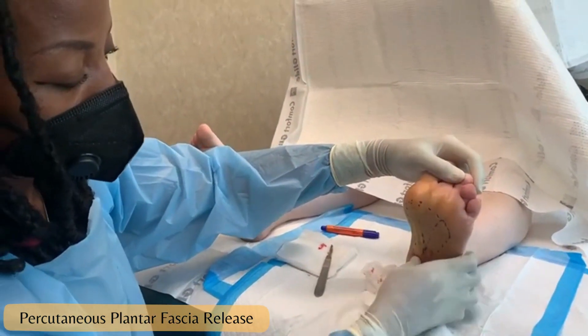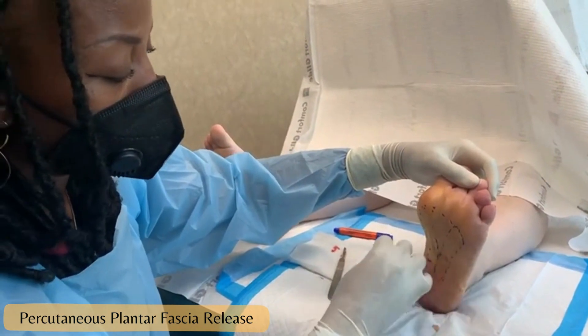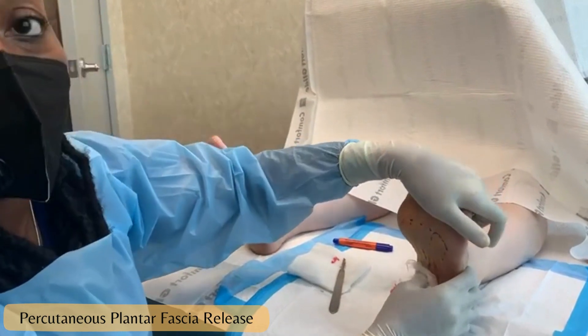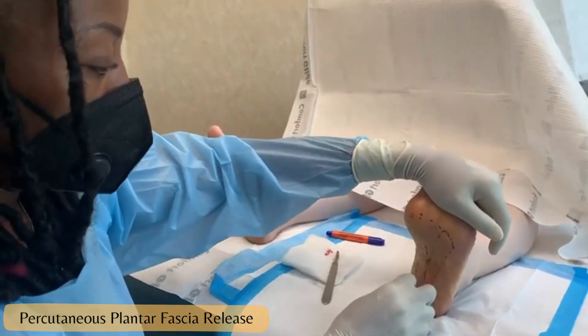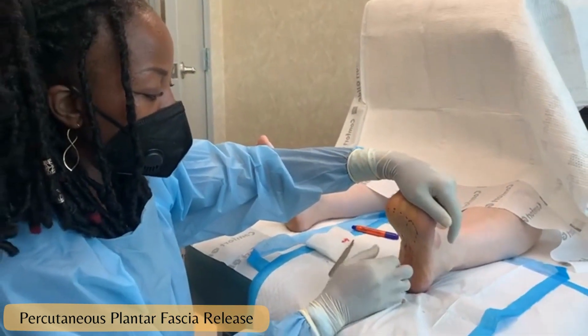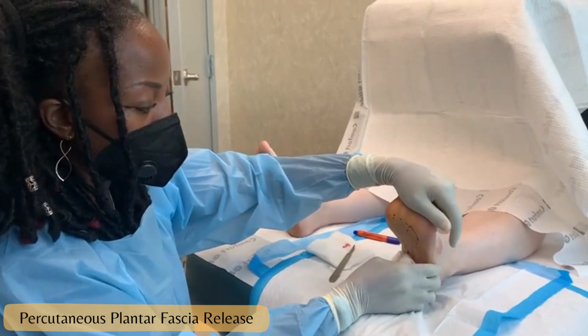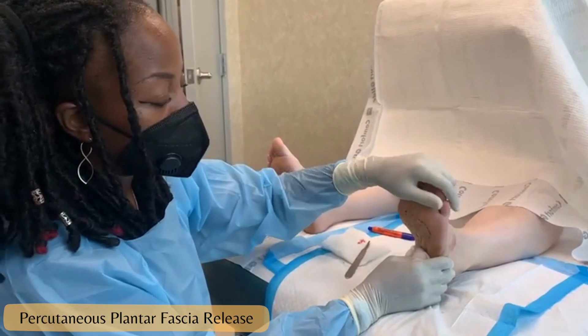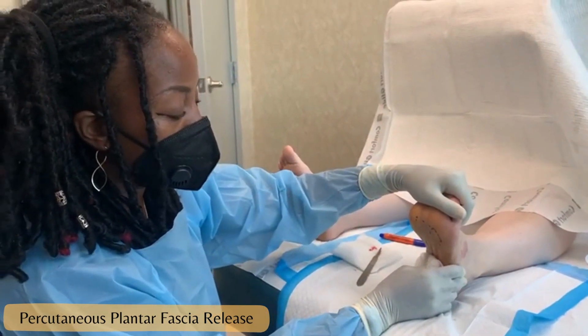We'll throw a stitch in and put on a protective dressing. The patient will return next week to check the wound and possibly remove those stitches at that time. The patient will ambulate in a cam boot until follow-up next week, then slowly transition from the cam boot into her sneaker with the orthotic.